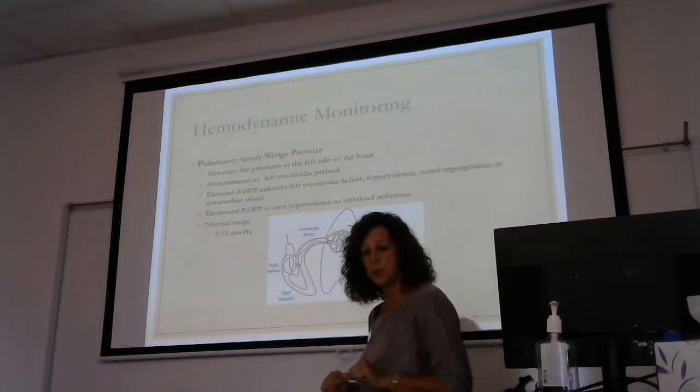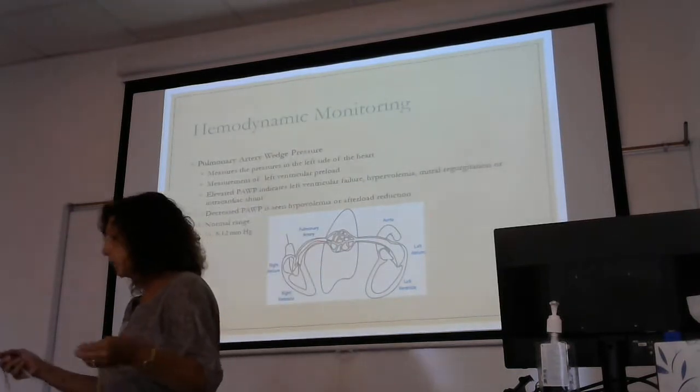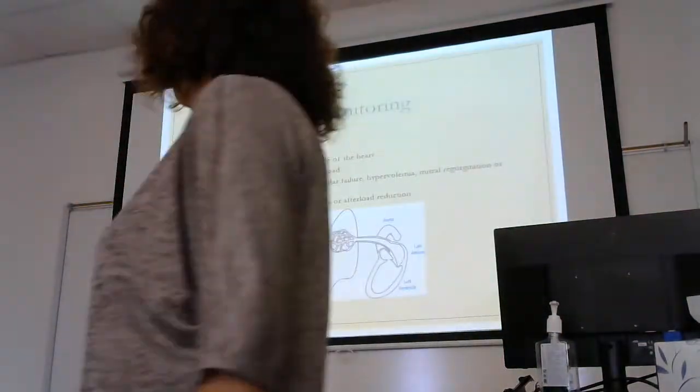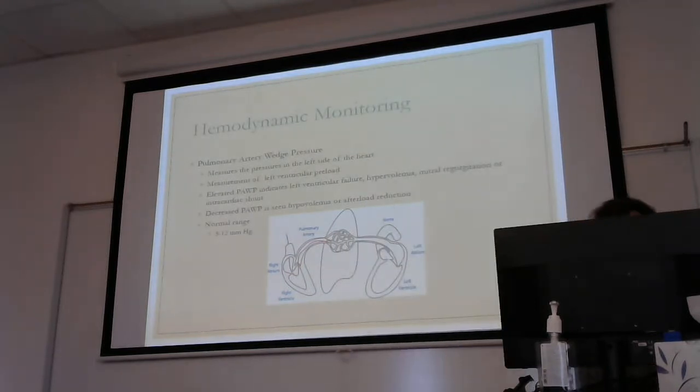This is the wedge pressure I was talking about a while ago. And I think my balloon's busted. I don't think it's going to work. In my day, RNs obtained wedge pressure. So what is a wedge pressure? Let's go back to, that's an okay picture, but I got a better one.